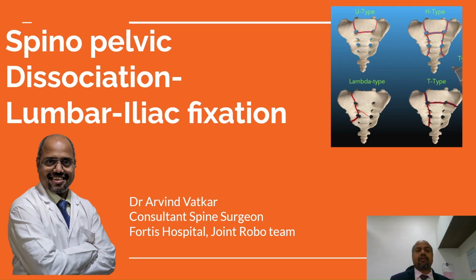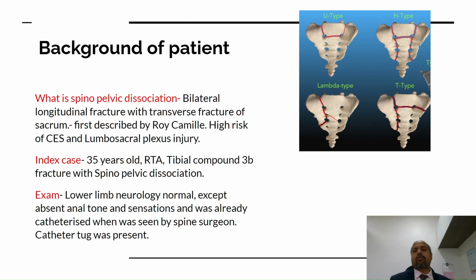Today we'll be discussing a case of spinopelvic dissociation in which we did a lumbar iliac fixation. So what is spinopelvic dissociation? Basically, it is a bilateral longitudinal fracture of the sacrum and also a transverse fracture of the sacrum, which was first described by Roy Camilli. And this kind of fracture has a high risk of cauda equina syndrome and lumbosacral plexus injury.